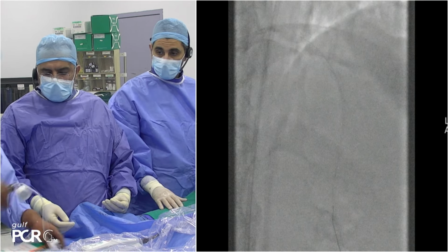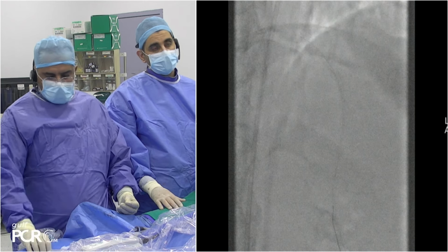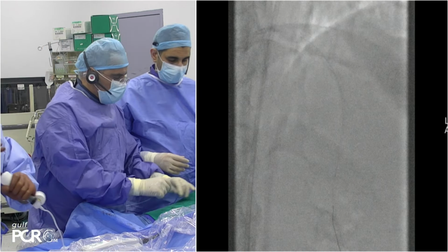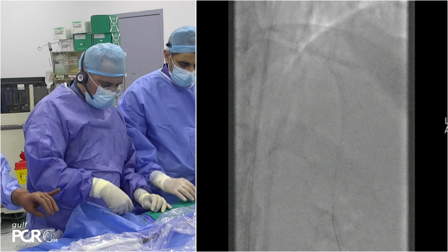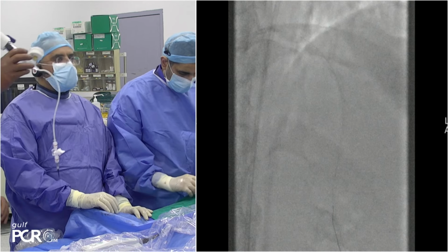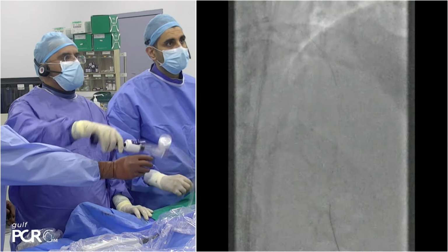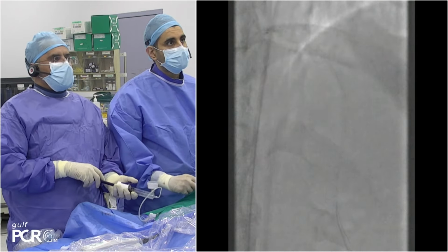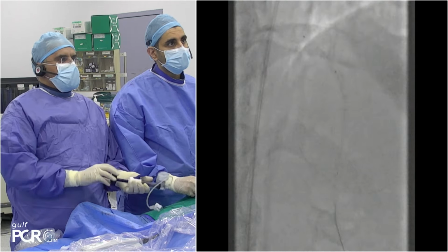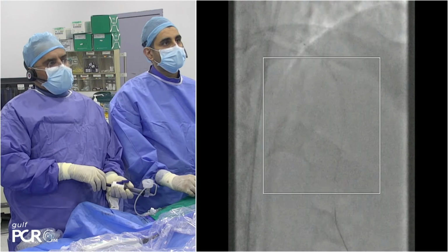And angiographically, could you detect or think of such a thing happening without OCT? I mean, what you see in the OCT at the distal edge of the stent is quite frightening. Could you show us an angiography of the same section, just to convince the guys who don't do OCT to do more OCT? Yes, I know. So we'll just do the post-dilatation. Let's do StentViz here. And then we'll show you the angiography.